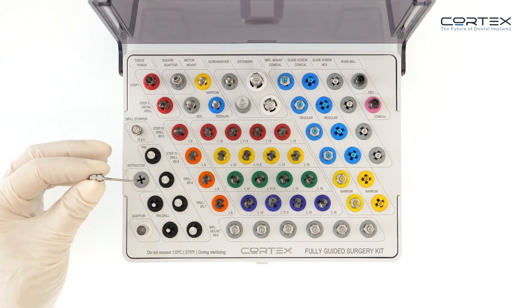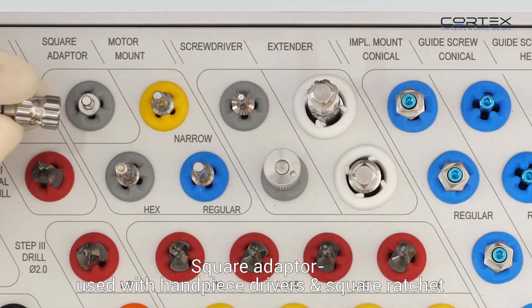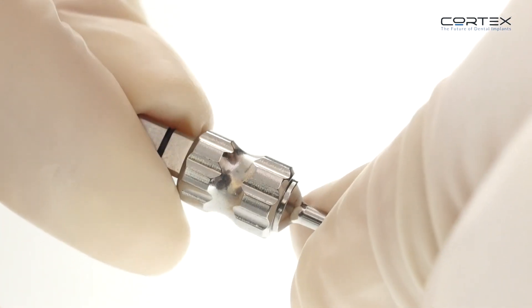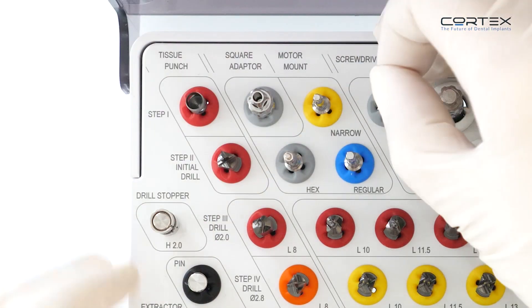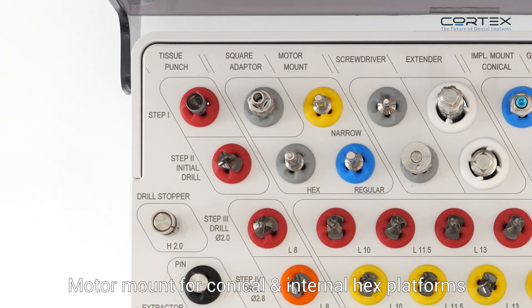Additional items include an extractor, screwdrivers, and a square adapter used with handpiece drivers and square ratchet, as well as a motor mount for conical and internal hex platforms.